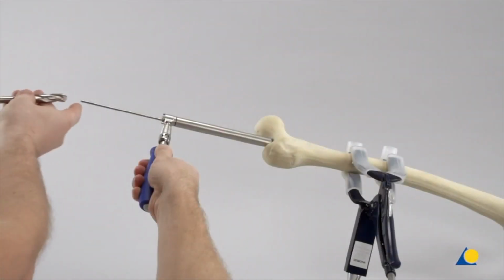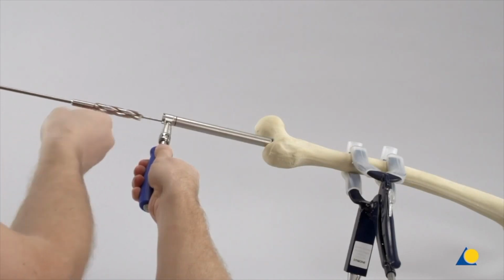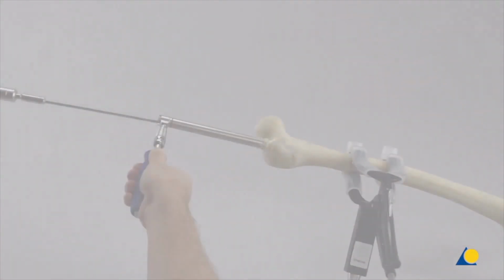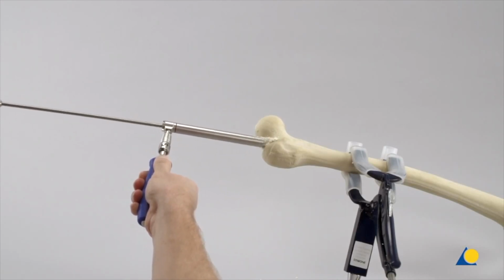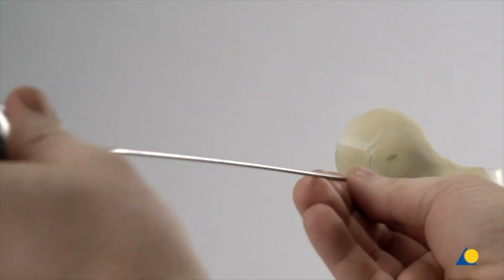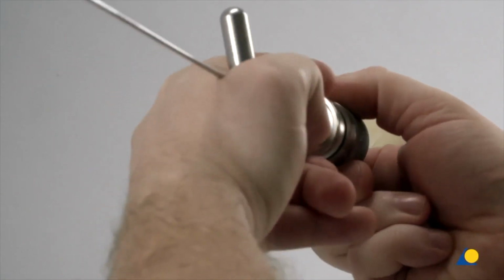The cannulated drill bit is passed over the guide wire and through the protection sleeve to the bone and drilled to an approximate depth of 10 centimeters. The cannulated drill bit, the guide wire, and the protection sleeve are removed. The reaming rod is passed through the universal chuck with T-handle and the reaming rod inserted into the medullary canal.